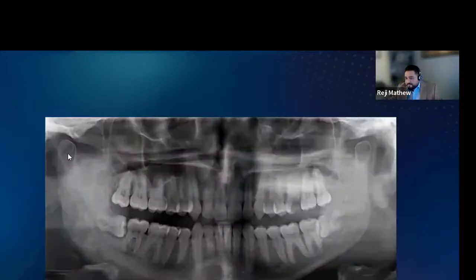This is a case. Look at this panoramic image, or an OPG as we call it. Even if I have taken this to evaluate the third molar, I wouldn't jump right into that third molar area and look at the third molar first. I would go systematically. I will start with my right condyle. I would go all the way down, and you could see some things happening here, which I would show you with a CBCT. But I would follow the ramus, and I will follow this inferior cortex. I would go to the opposite side.